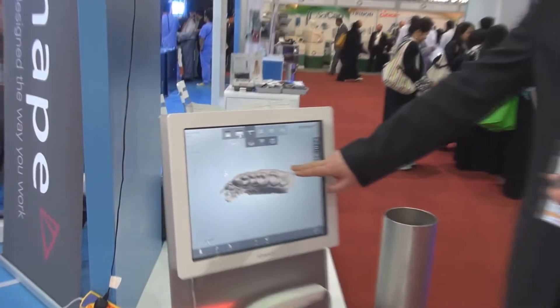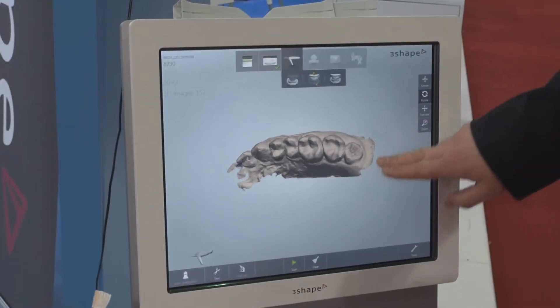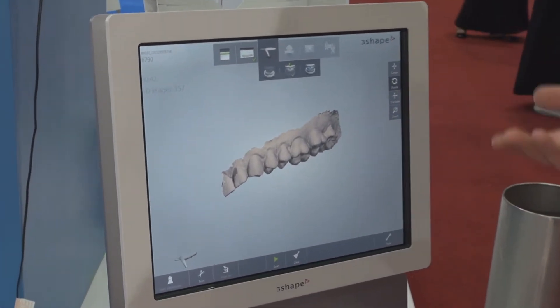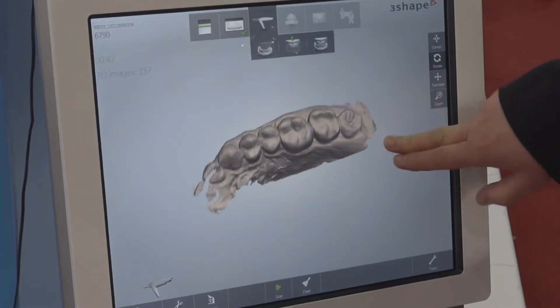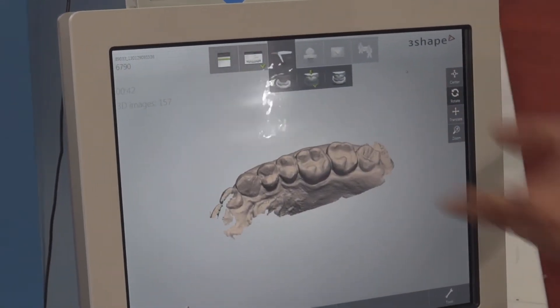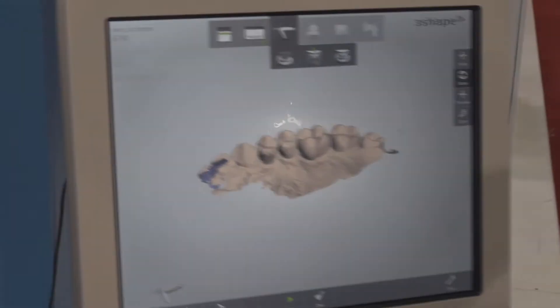What's also good about taking a digital impression, comparing to the traditional way, is first we can see a positive of our scan. Taking a regular impression, we have a negative — it's really difficult to judge how good the impression is, and as you probably know, it's really difficult to take an impression in the traditional way. In here we can see everything straight away and it's really difficult to make any mistake — it could be detected pretty easily straight away.